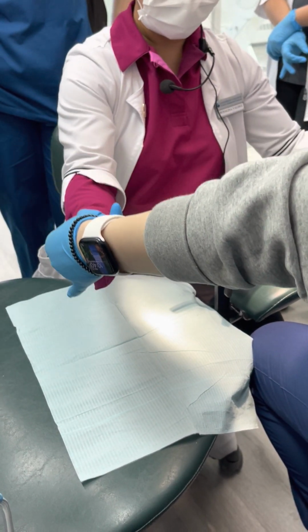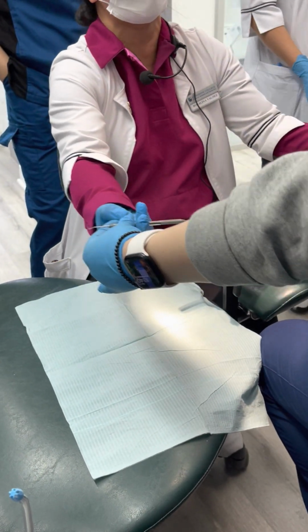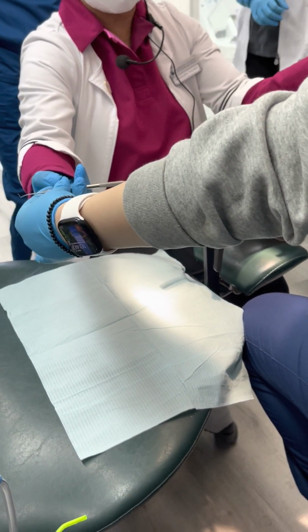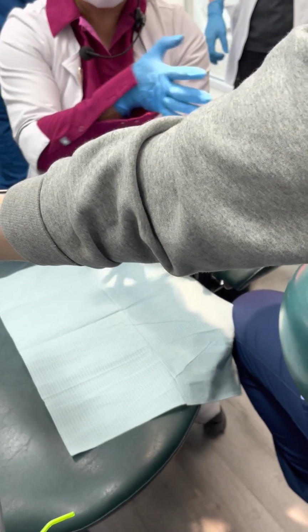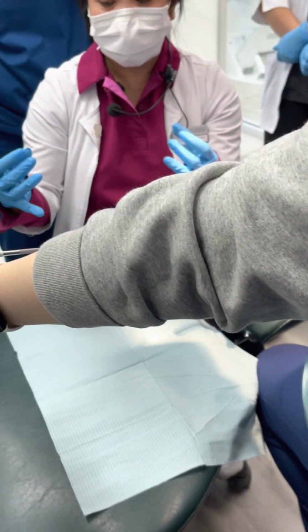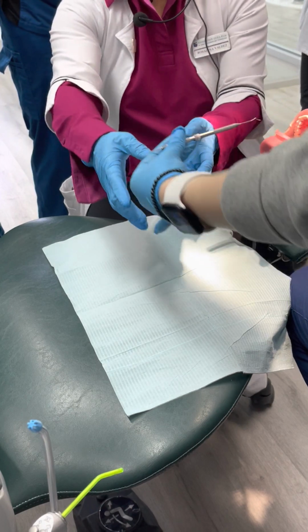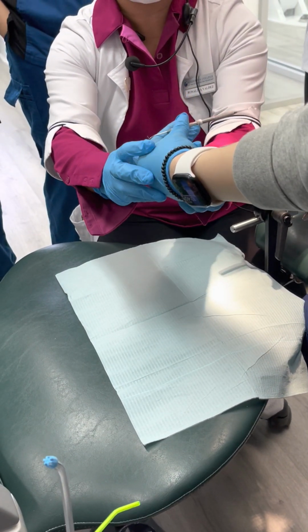You hold it like that, or you pass it like here. Do not pass it here, you might drop it. You pass it together. Put it together like this.